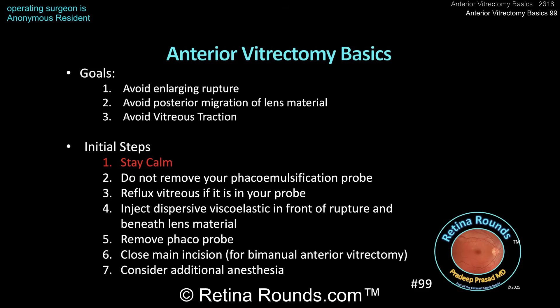Let's pause and talk about what you do at this moment. You've got a posterior capsular violation. The anterior hyaloid face may be intact and vitreous may not be coming forward. You want to avoid enlarging that rupture, which may create a higher likelihood for nuclear or cortical fragments to migrate into the posterior segment. And if vitreous is coming forward, you want to avoid vitreous traction. The first and most important advice: try to stay calm. This is not something you expected, but you have to stay calm so everyone in the room stays calm, and you can make better decisions if you take a breath and try to salvage the situation.